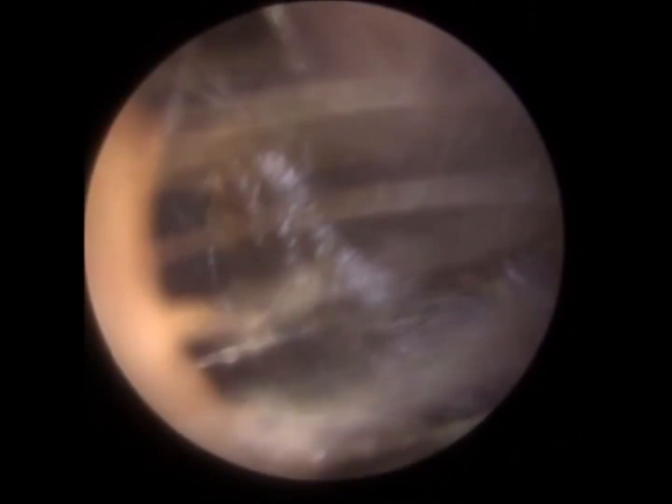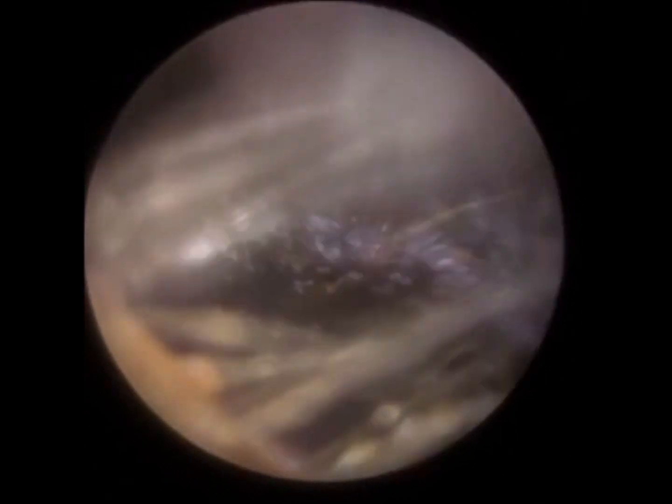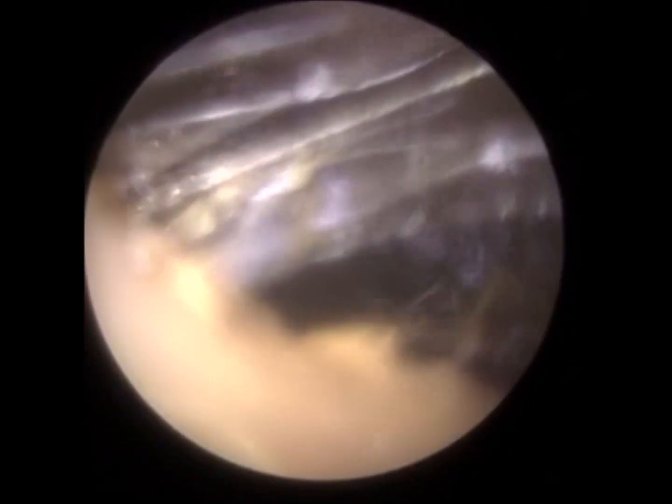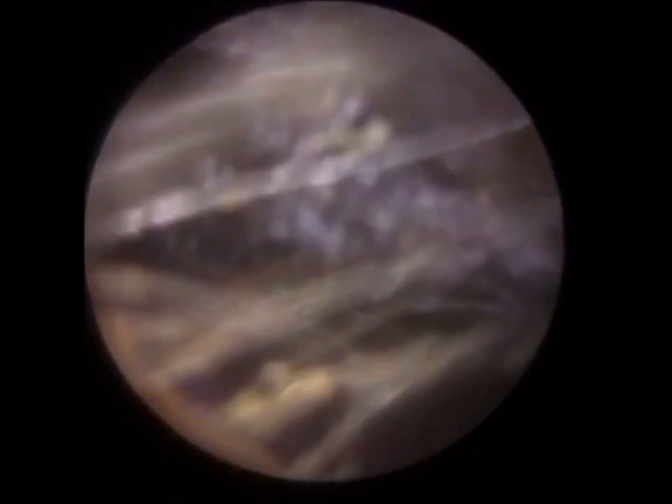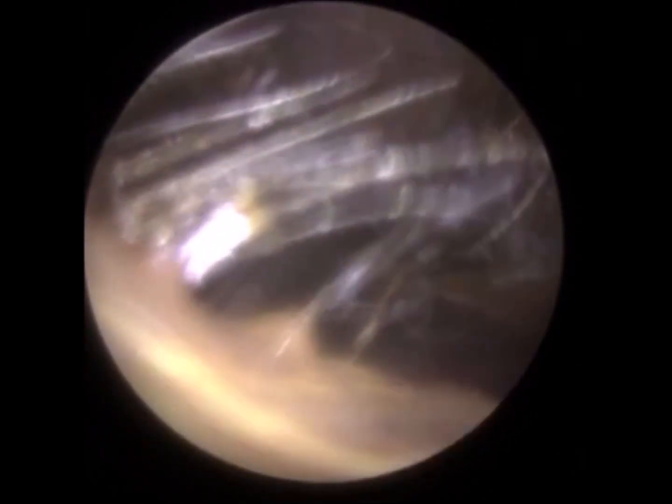See, there's a few hairs there, and I know a lot of viewers don't like the hairs. I know they're slightly obscuring the view, but for me, the specialist, it's not really affecting me, so it's best left well alone. We trim those, they'll come back. They might even come back quicker, a bit thicker.